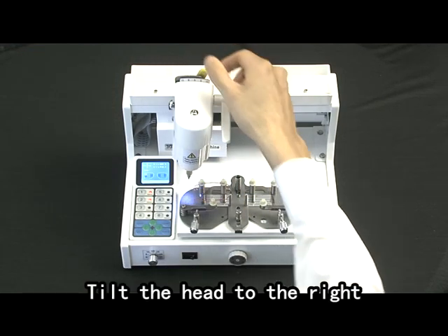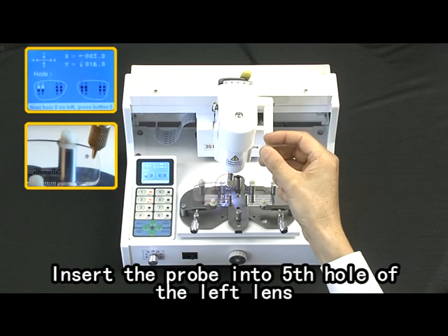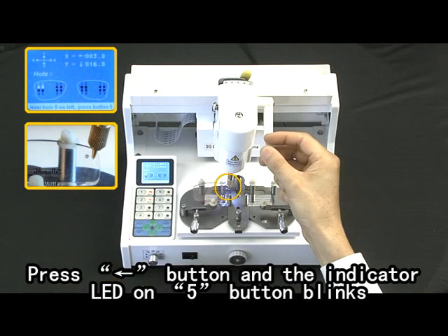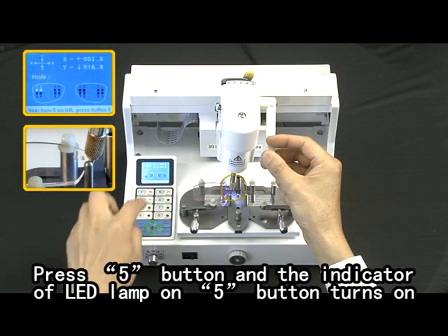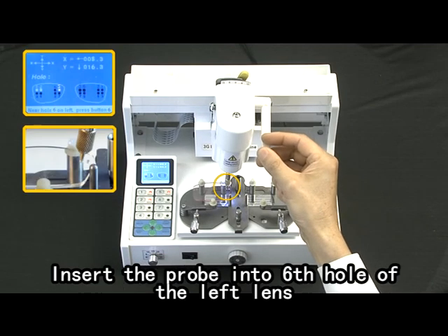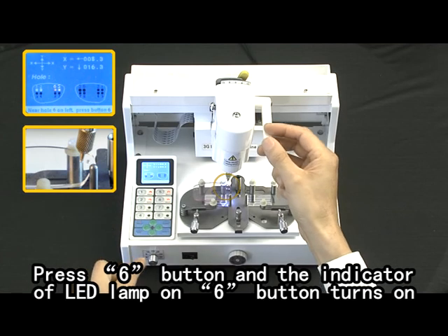Insert the probe into the second hole of the left lens. Press the two button and the indicator LED lamp on the two button turns on. Tilt the head to the right. Insert the probe into the fifth hole of the left lens. Press the left arrow button and the indicator LED on the five button blinks. Contact the taper portion of the probe to the edge of the left lens outside of the fifth hole. Press the five button and the LED lamp turns on. Insert the probe into the sixth hole of the left lens. Press the six button and the indicator LED lamp on the six button turns on.